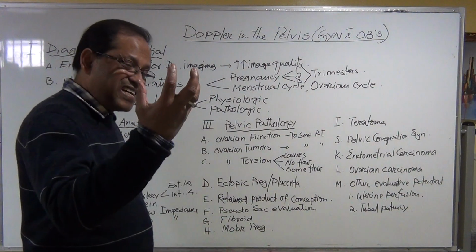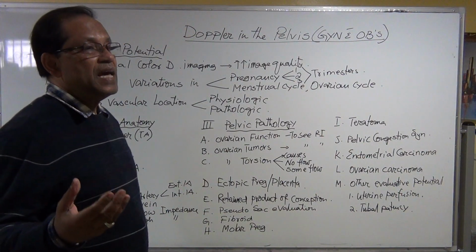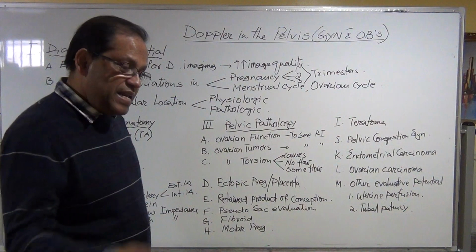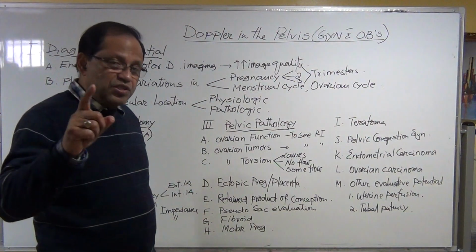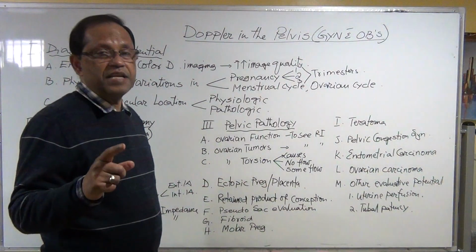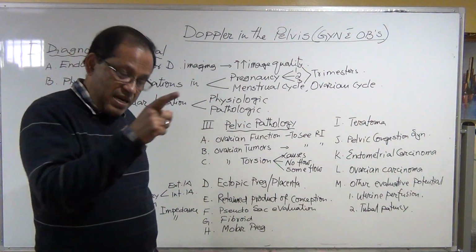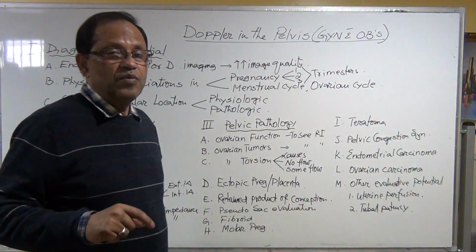the fluid that accumulates inside the uterine cavity, and it looks like a gestational sac, but it's not round, not oval, it could be elongated. And you might be confused that, oh, I see the echogenic ring around it, but it is not a double decidual sac reaction. It is not. It is the endometrium around it. But this collection of fluid is tubular shape, okay, elongated form.